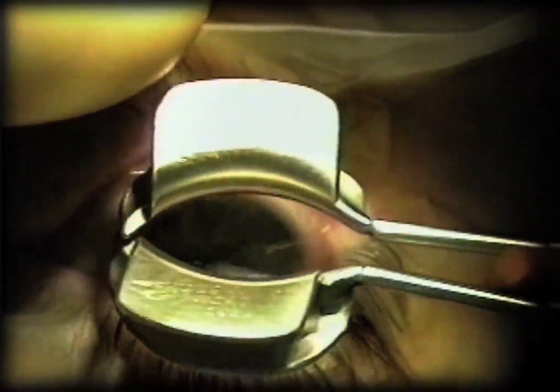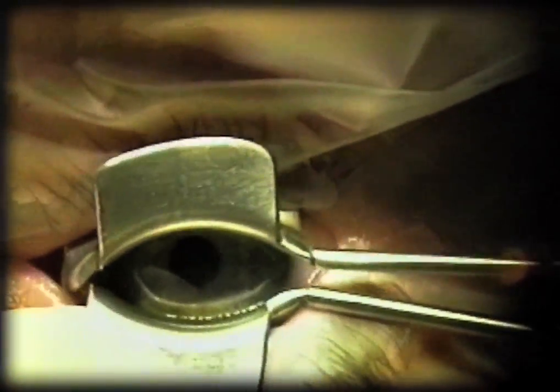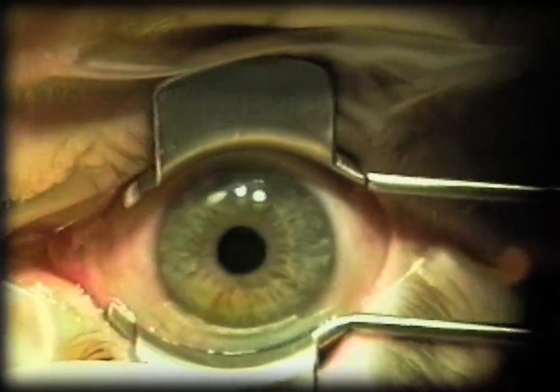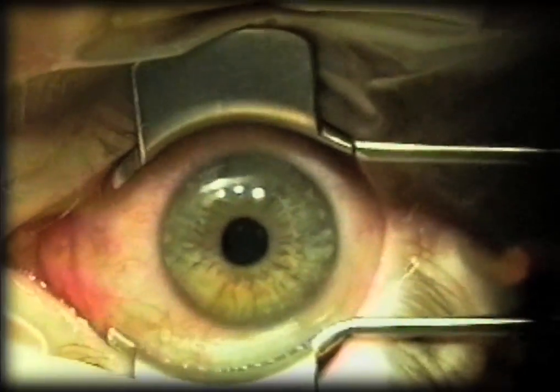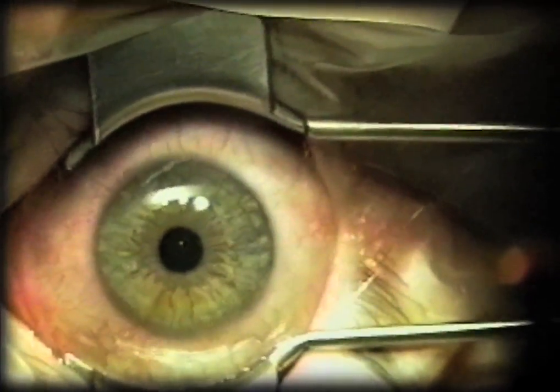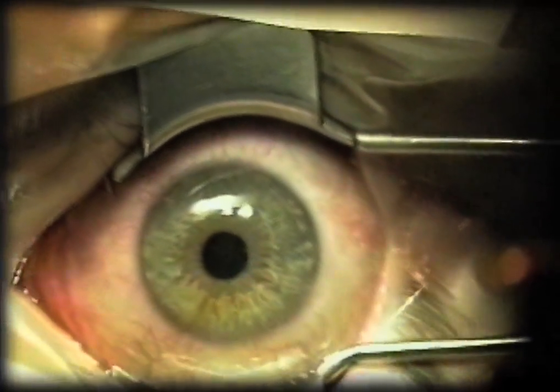This is a tighter orbit with a smaller palpebral fissure. What I do here is slowly advance the opening of the speculum and let the patient start to relax. This one is pretty tight, but we're able to accomplish it anyway.